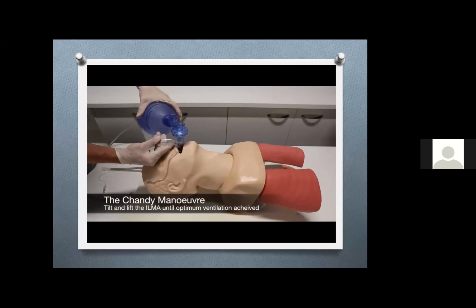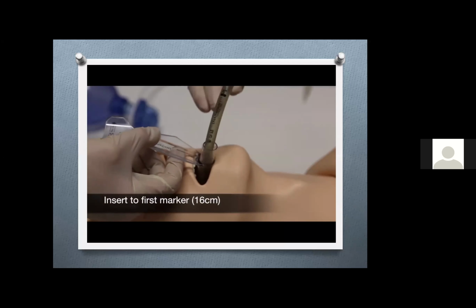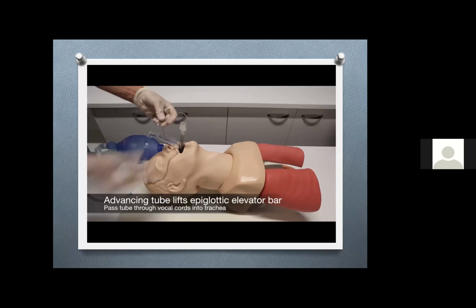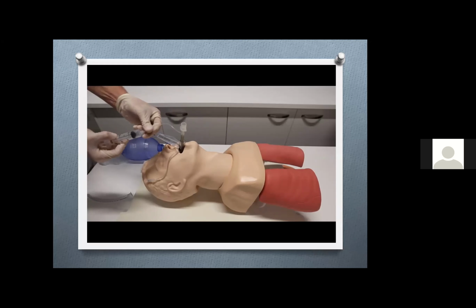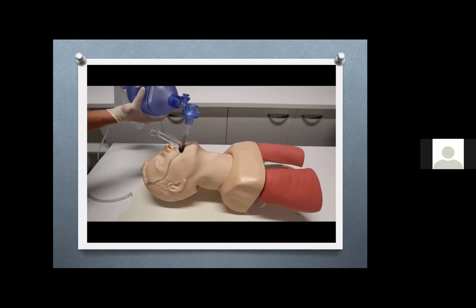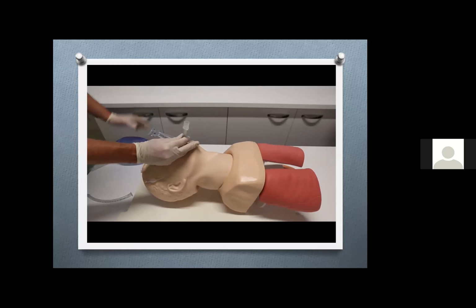Just notice that he pushed the handle a bit lower so he could get the cuff inflated. He keeps holding the handle. Now you just push the tube down through the LMA, and that's it. Inflate the cuff of the tube. Make sure it's secure, then you start bagging. Very nice and very easy, and you don't need a lot of skill to do it.